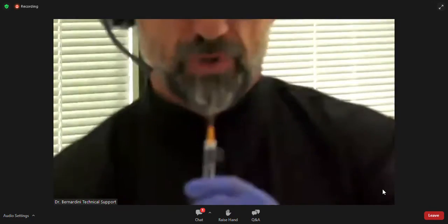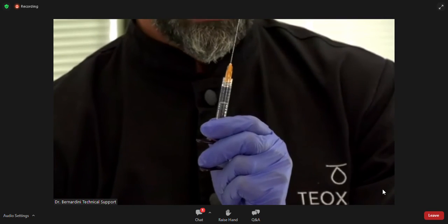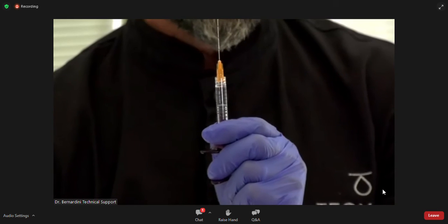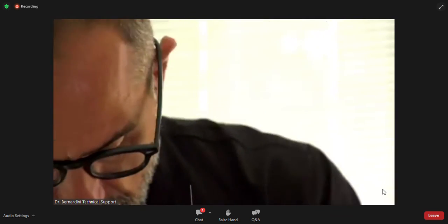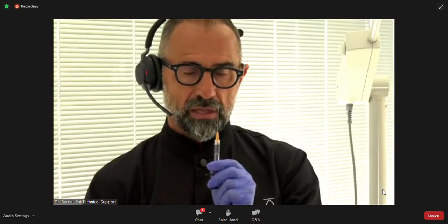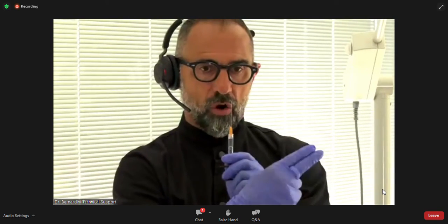So up to now, I've injected... Can you focus and zoom on the syringe? I'm going to show you the number. So this is about half of a syringe being injected for phase 1. This is giving support to the mid phase, an indirect treatment. Again, focus on starting with the G point and the V lift, and then orbital padding laterally and medially, giving support to the lateral orbital retaining ligament and the tear trough ligament.